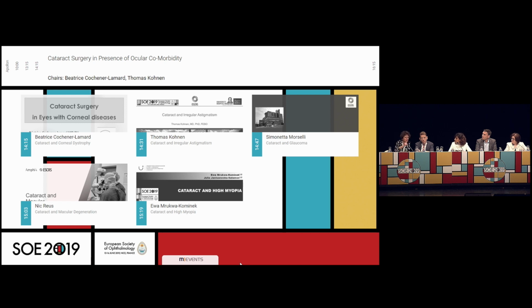DMEK is just the removal of the endothelium, while DSEK is a very thin layer of stroma that you transfer with it. And actually, it's an ultra-thin DSEK now. I think that when the corneal edema is quite strong, and when the anterior segment is challenging, like if, for instance, you need to use an iris claw because the patient has a complicated anterior segment, for me, that's still the place for DSEK. Would you agree on that?